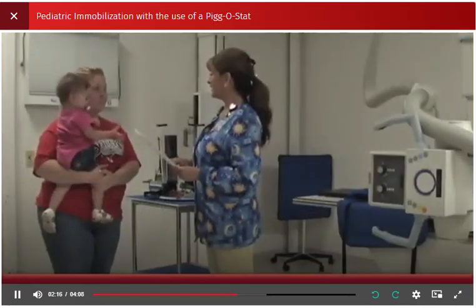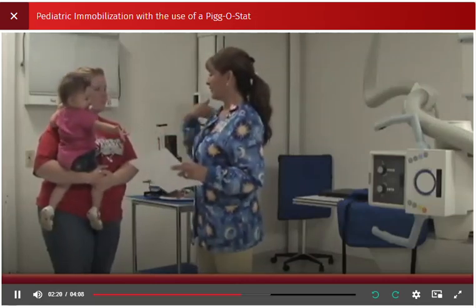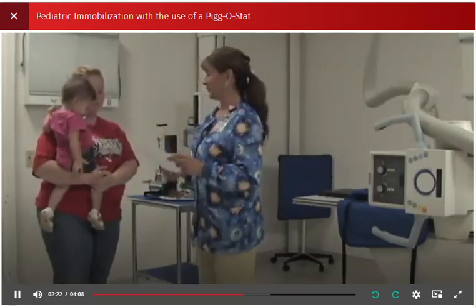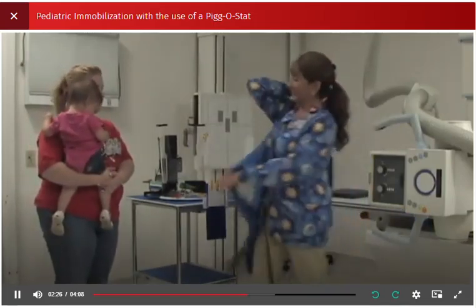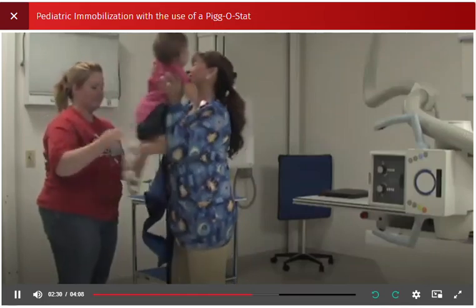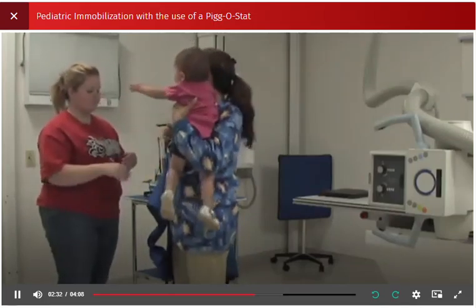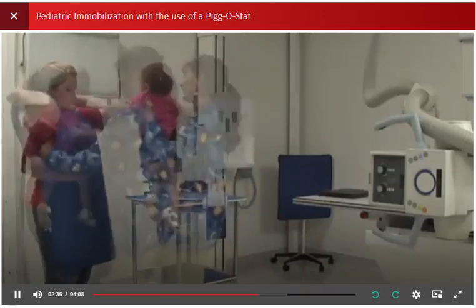Keep in mind that departmental protocols vary regarding parent participation during image procedures. This is a demonstration with parent participation. Begin giving the parent a lead apron. If the parent is the mother, make sure to ask for possibility of pregnancy. If she is not pregnant, verify her last menstrual period date.